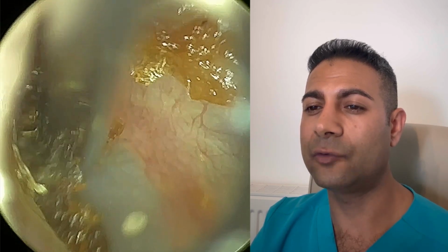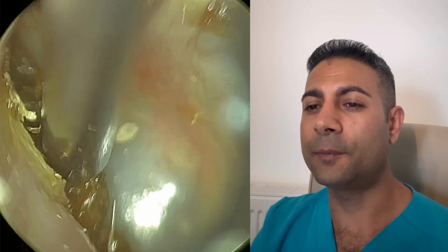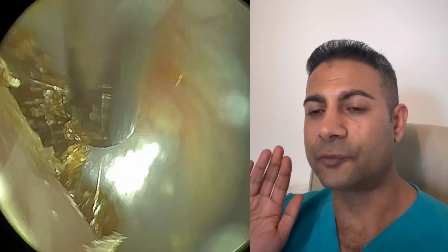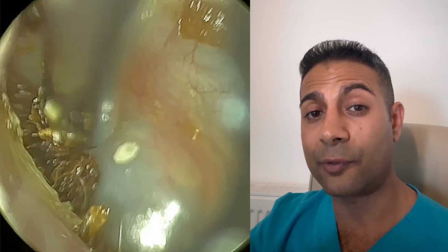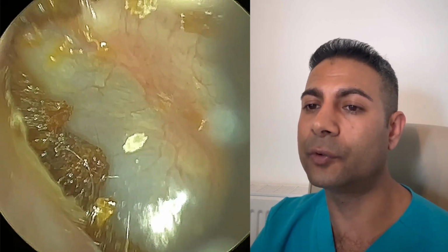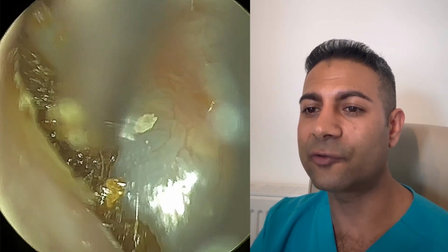So again, we're entering the anterior recess. You've got to be careful not to push the suction probe too hard, because otherwise you're going to be just smothering and pasting the soft wax and further compressing it and embedding it against the eardrum. So you almost want to hover over the top if possible and let the suction work its magic to bring it away.